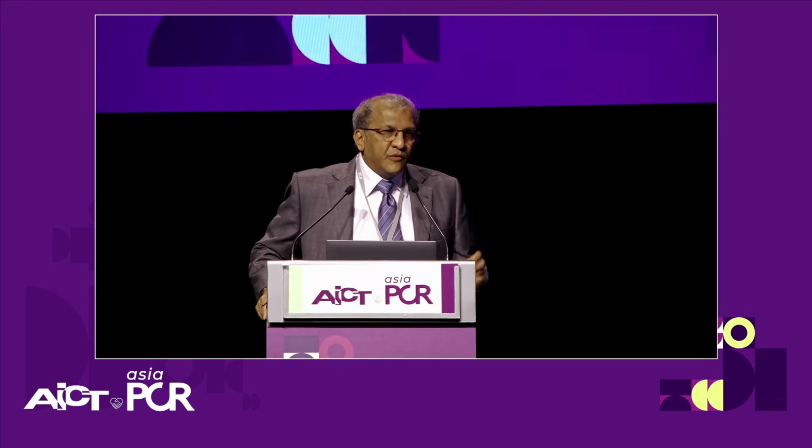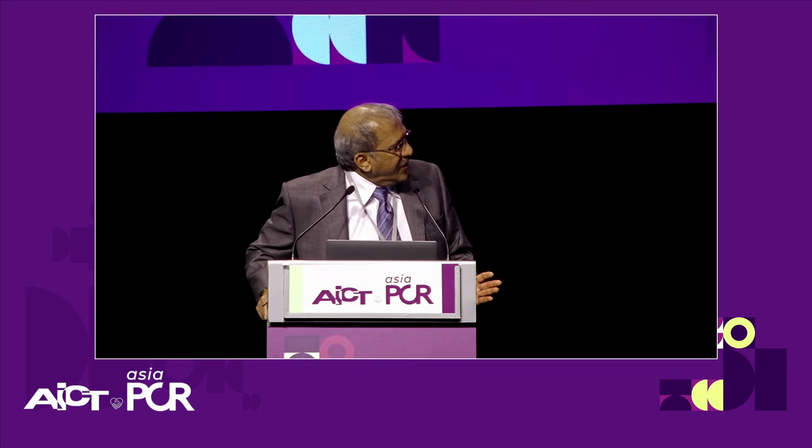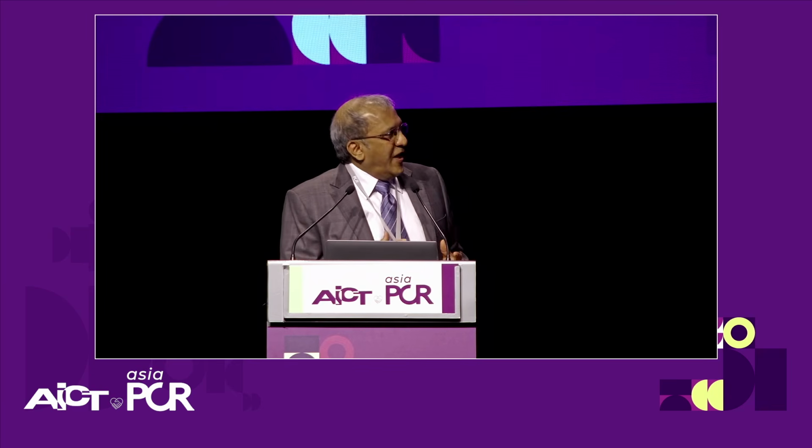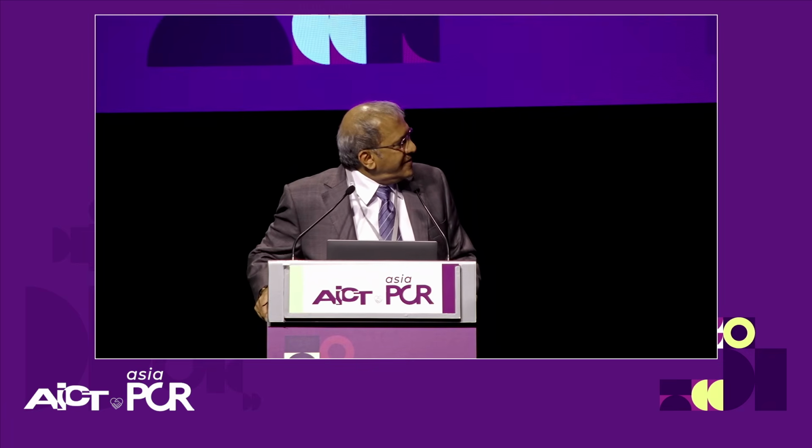So one way would be to take it out, do an IVUS, and see if you've done enough, and then go back. Don't do it. Put in an extra train or two and come out. And what is the worst case scenario? Take another balloon, right? But if you can ration, you have 120 pulses, so you can more or less figure out how you need to distribute them in these diffuse complex lesions. What do you think is the minimum number of pulses in one location that you need to give for it to work?